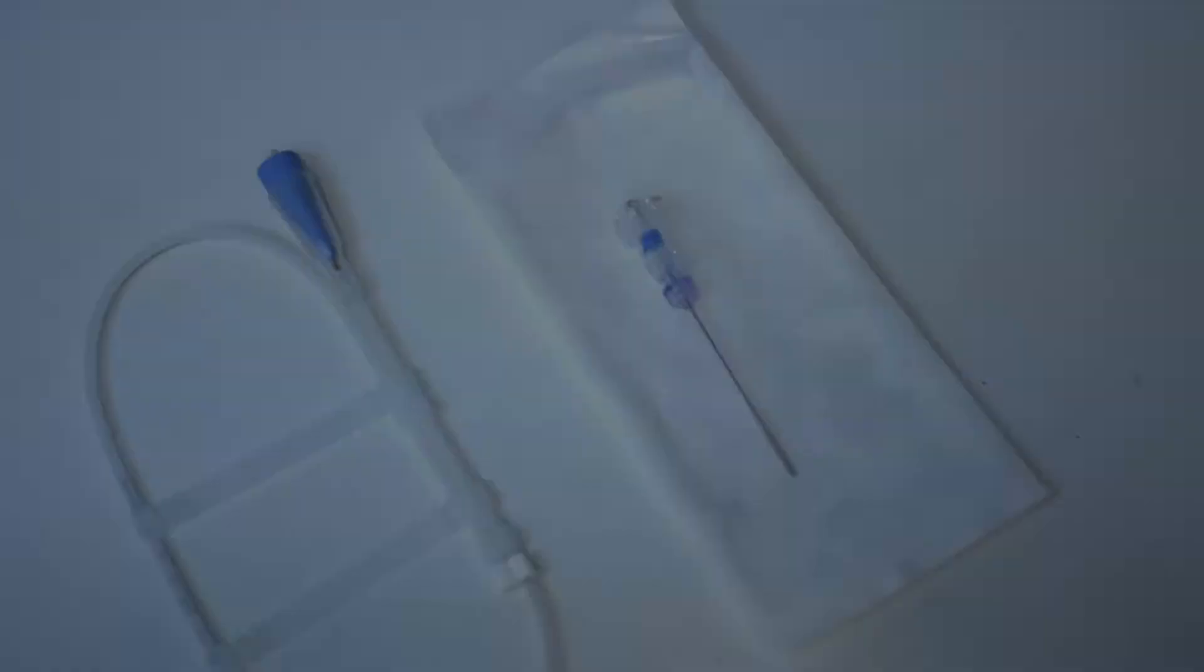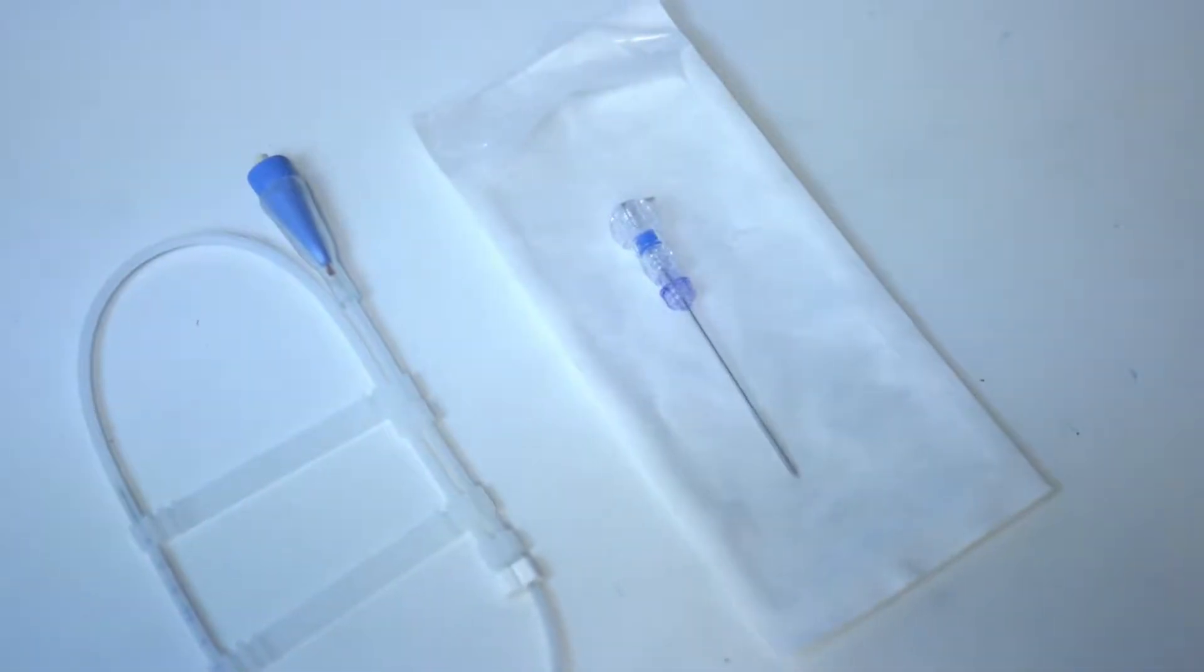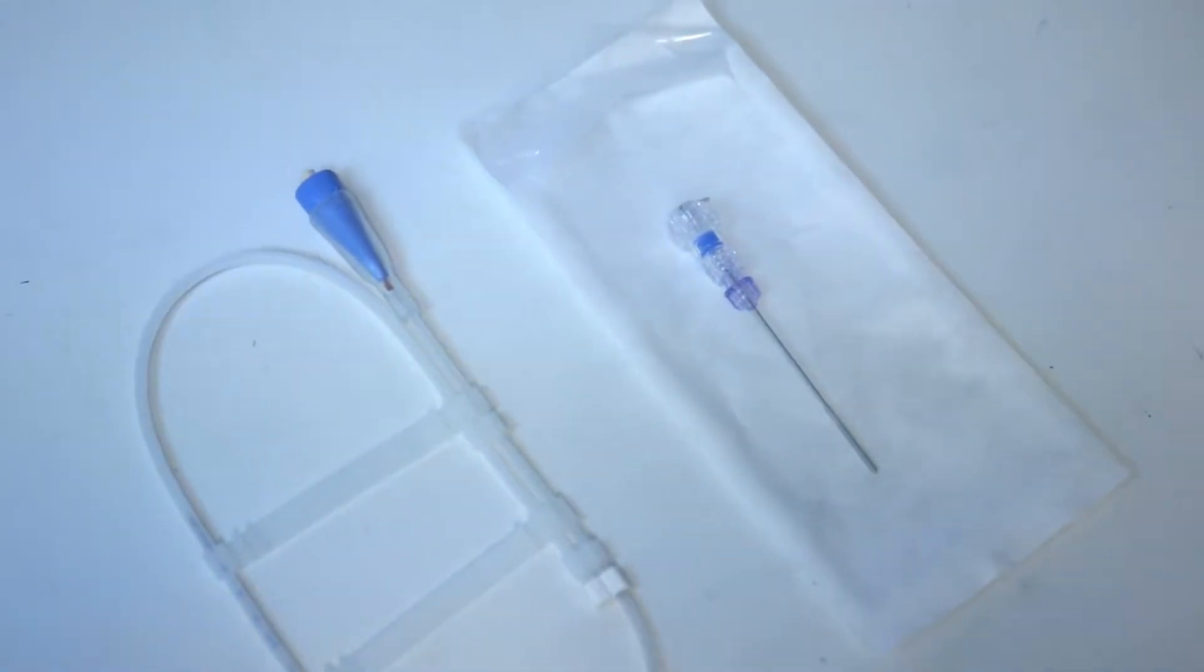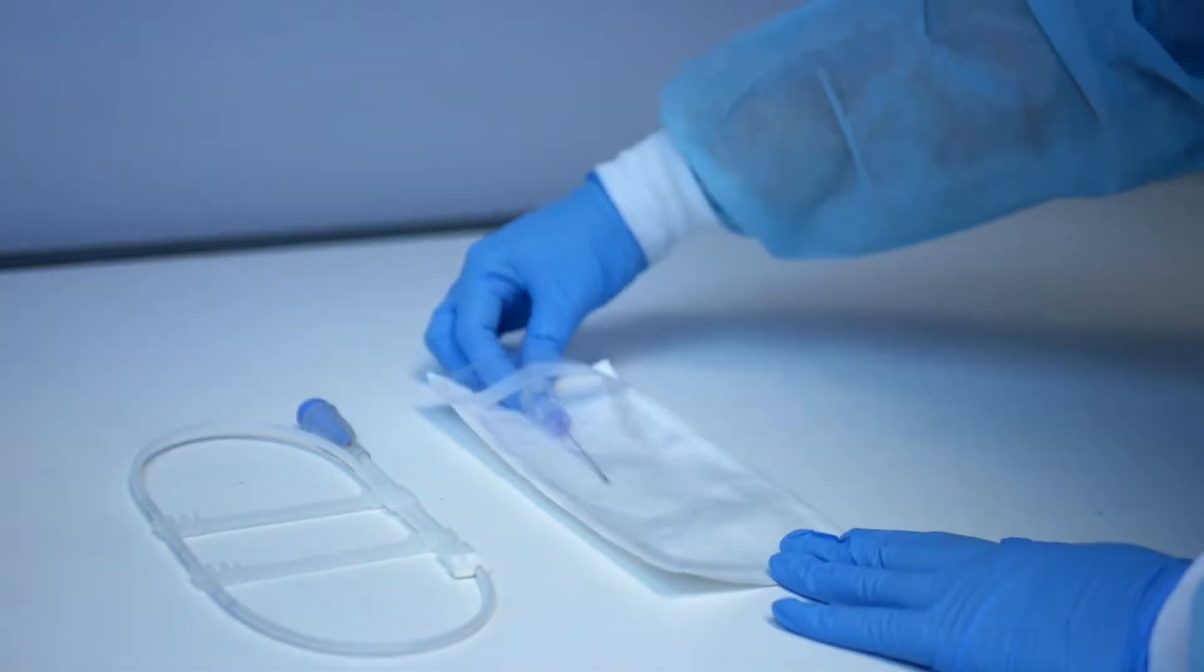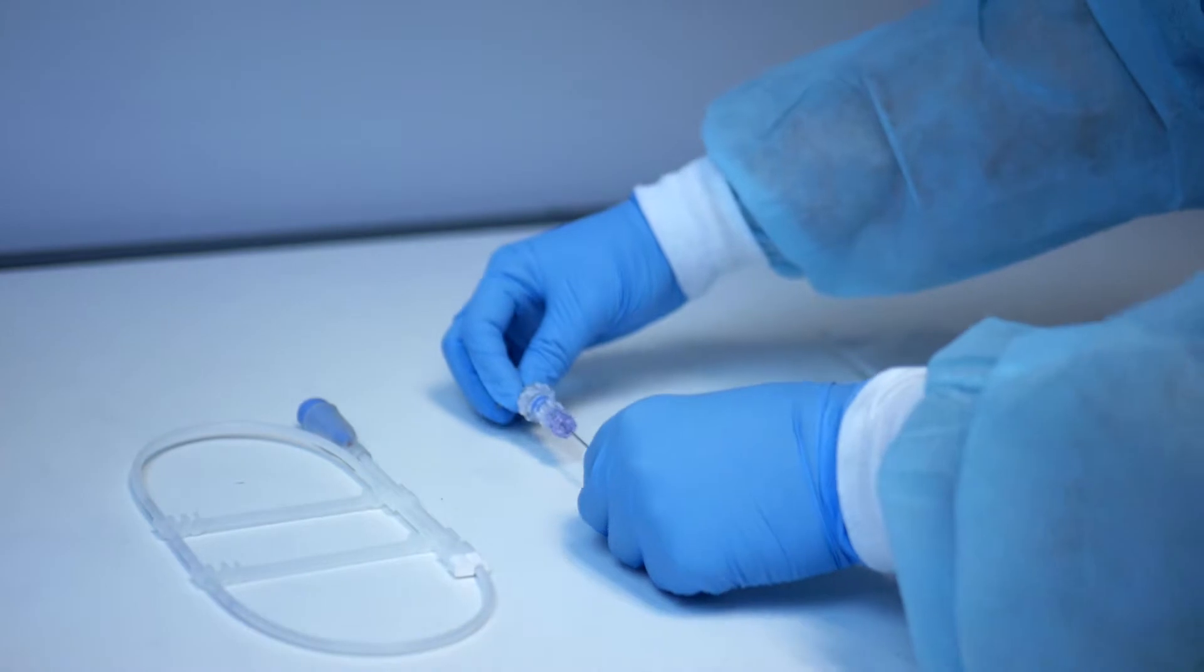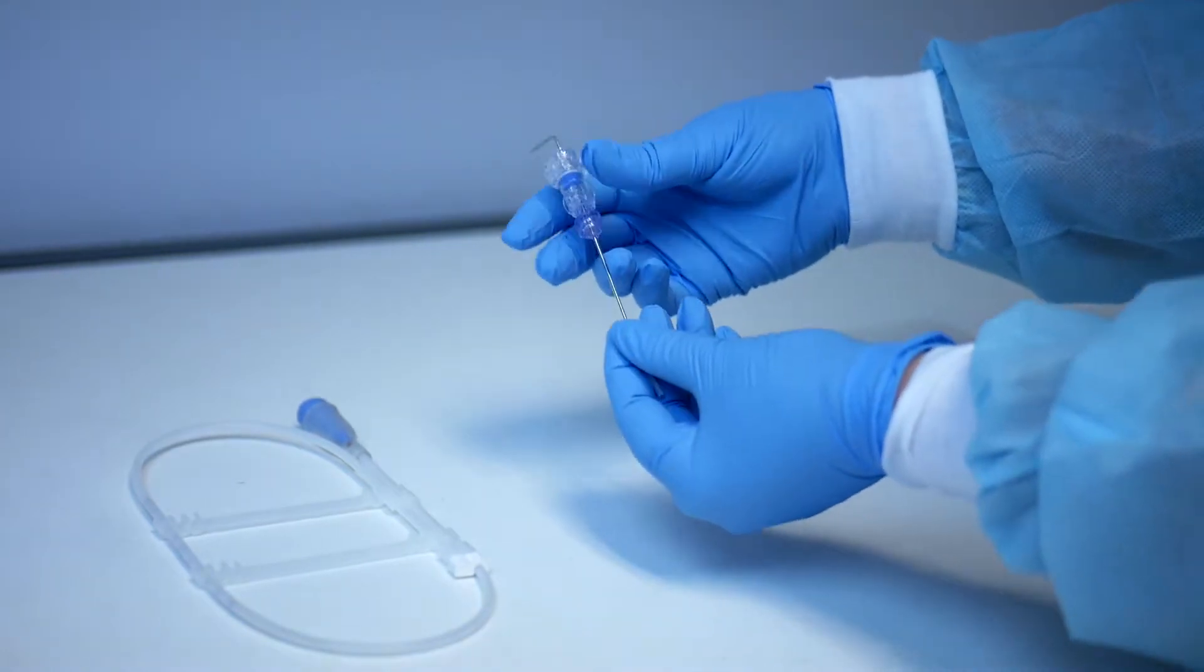Ensure you have both the Hemetix Q-Flow 500 perfusion probe and the probe durapiercer and introducer kit. Remove the probe durapiercer and introducer from its packaging. Remove the silicone tubing at the end of the durapiercer.